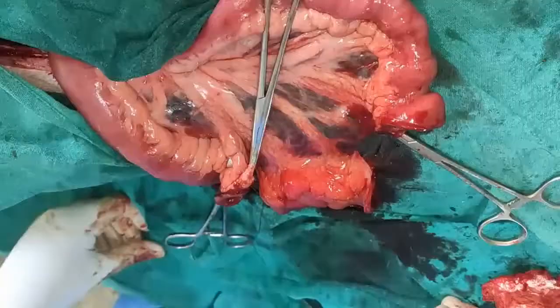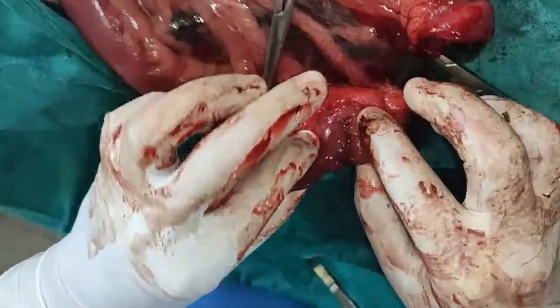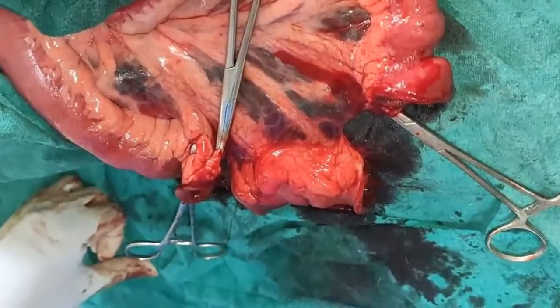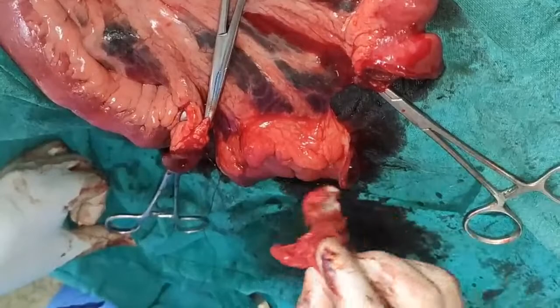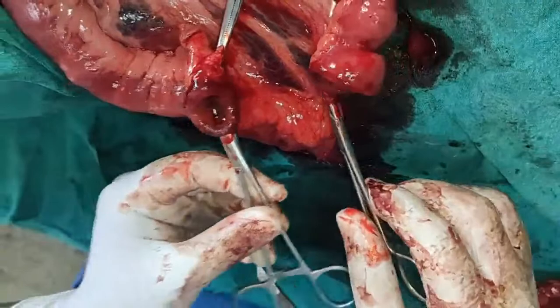Even after stitching this one, two layers, three layers, there is still a leakage after milking, and moreover this is a necrosed area. I tried a simple repair first in the longitudinal direction, then in the transverse, but still there is some problem in the necrosis area. So I ultimately decided to resect this much intestine, and now I am going to suture it as an end-to-end anastomosis. I think that will be better.